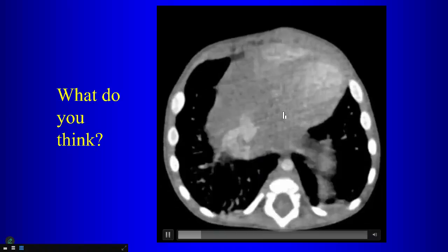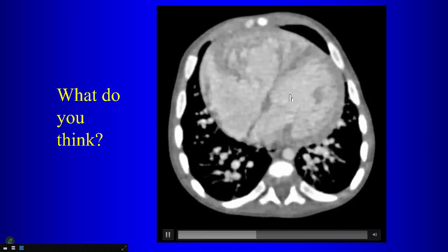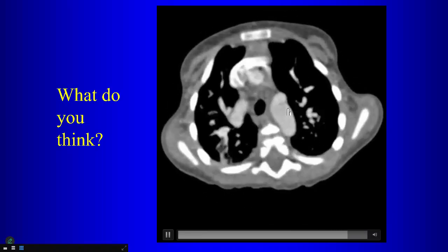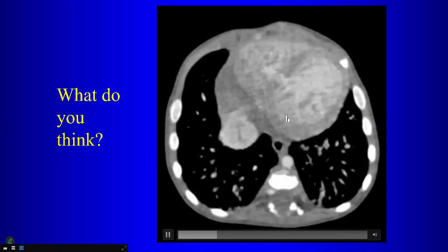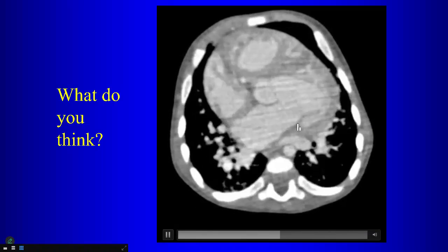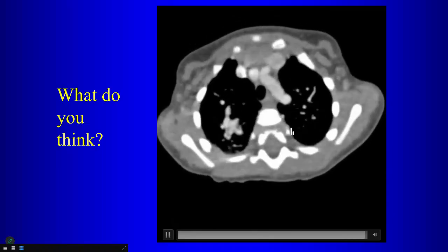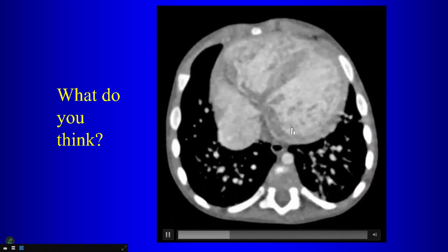So again, as we go through the heart, we've identified the atria, we've identified the ventricles that they connect to. Then when we look here at the ventricles, between the right and left ventricle, did you notice anything? Okay, let's go through that again. There's right ventricle, left ventricle, and between them we notice there's a VSD. Yeah, there's a small VSD, right? So the right atrium connects to the right ventricle, so there's atrioventricular concordance or discordance.